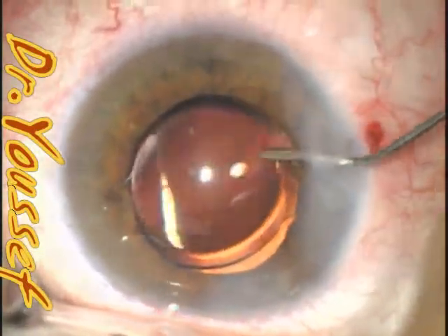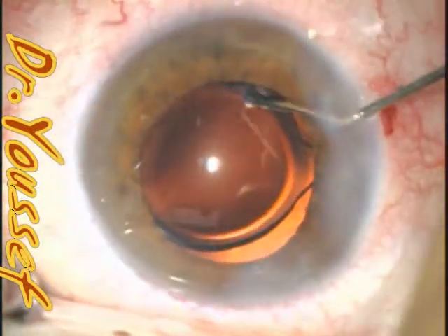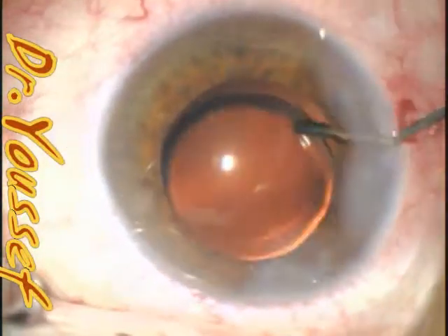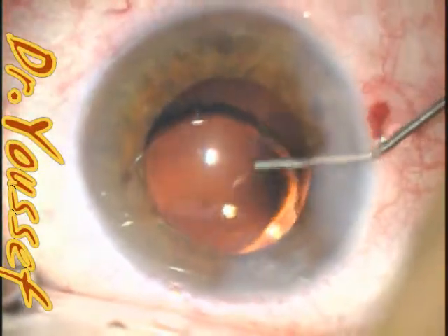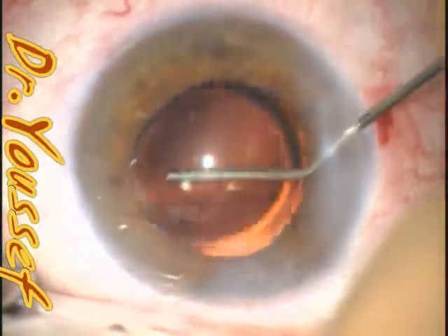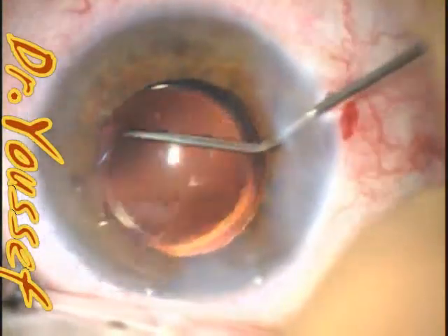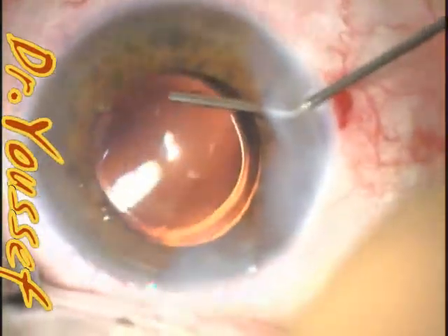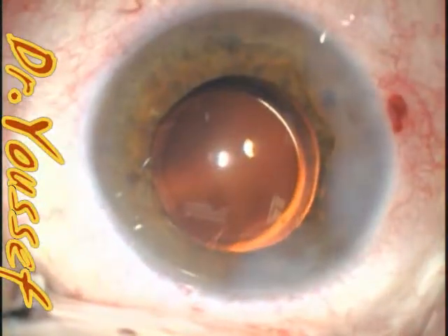Especially with single-piece lenses, it has to be in the bag — there's no option to put it in the sulcus. It has to be discovered during the surgery to be corrected. Otherwise, you end up with pigment dispersion, glaucoma, and uveitis. So take your time and make sure that the intraocular lens is positioned properly at the end of the surgery. Thank you.